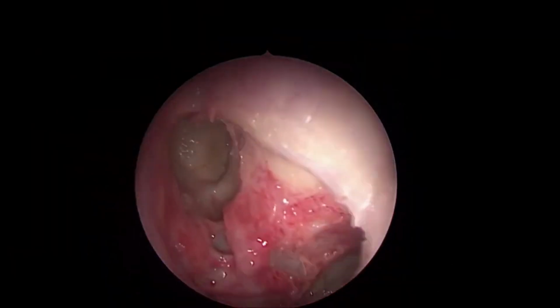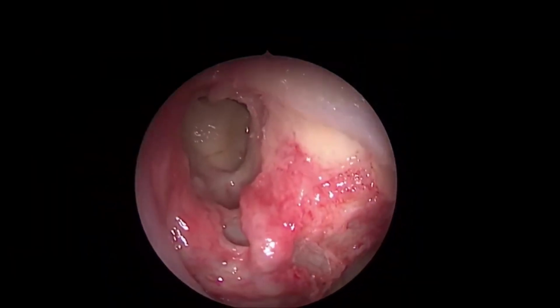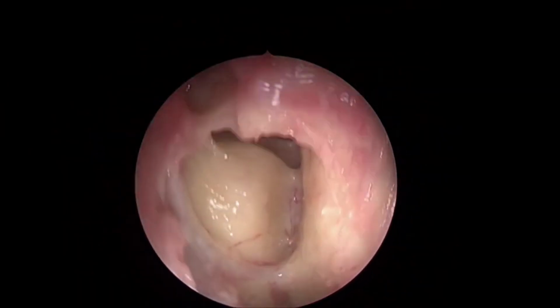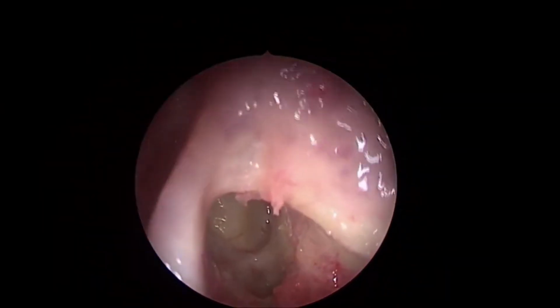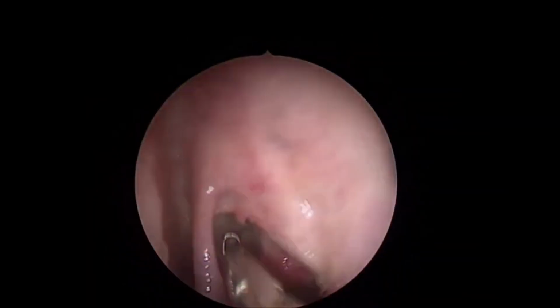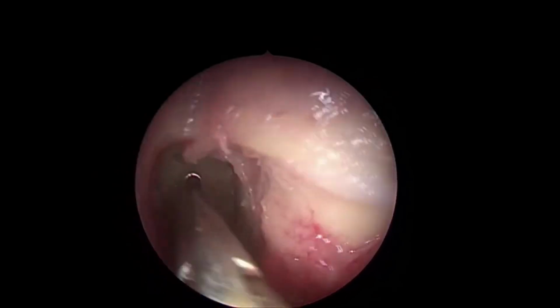So we'll discuss that in detail. The only thing I wanted to point out at this point is that only the anterior wall can be expanded safely. And that is how we expand our entry into the anterior wall. Now, I'm showing you one tool. I call it an articulated punch.